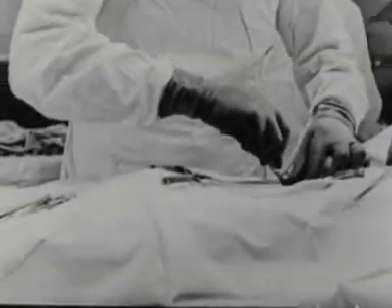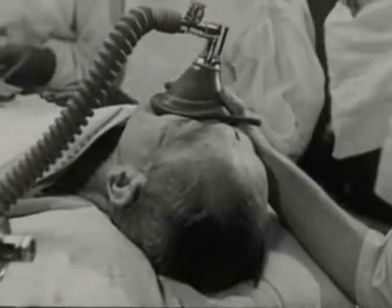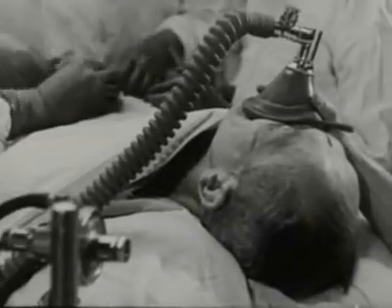As the anesthesia progresses, the patient's tissues gradually become saturated. After about half an hour, you will find that appreciably less ether is needed from the machine to keep him at the same depth of anesthesia.